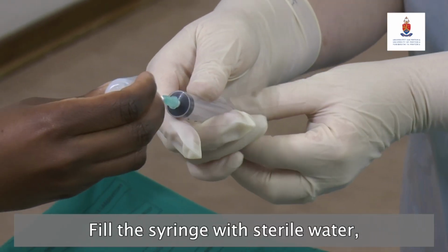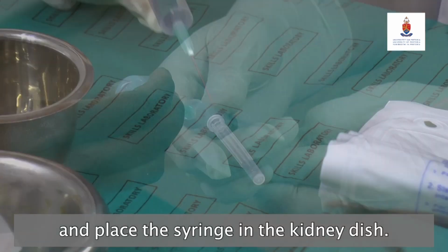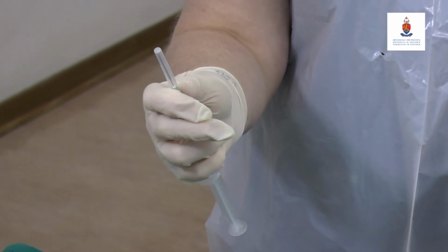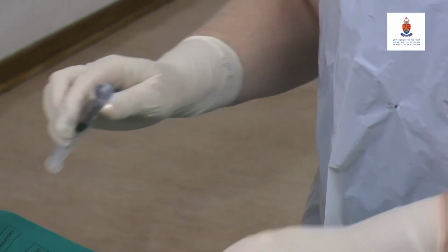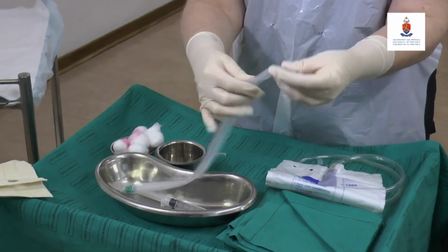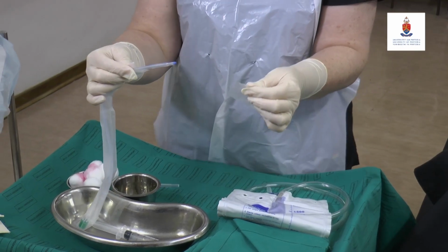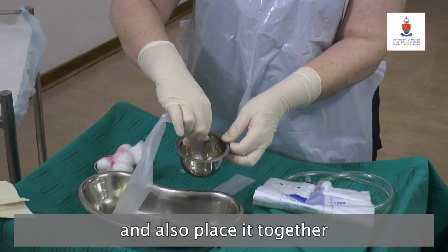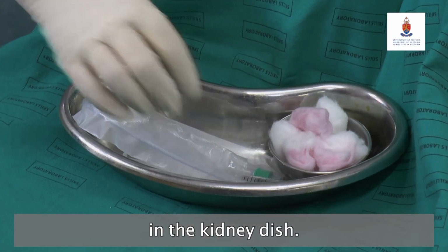Fill the syringe with sterile water, remove the needle, and place the syringe in the kidney dish. Lubricate the catheter tip and also place it together with some cotton wool swabs in the kidney dish.